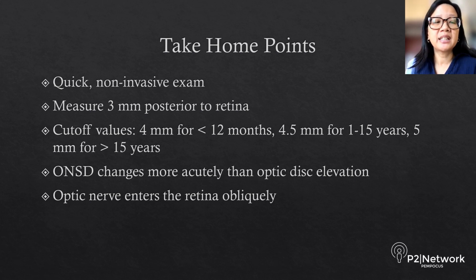Sometimes on these ultrasound exams, you can see optic disc elevation. Remember that this can take days to weeks to develop, and optic nerve sheath diameter changes more quickly. Finally, also remember that when you're measuring optic nerve sheath diameter, there can be shadowing around the optic nerve that results from shadowing from the lamina cribrosa or acoustic shadowing. This is artifact, and if your measurement includes this artifact, you can get a falsely elevated optic nerve sheath diameter.